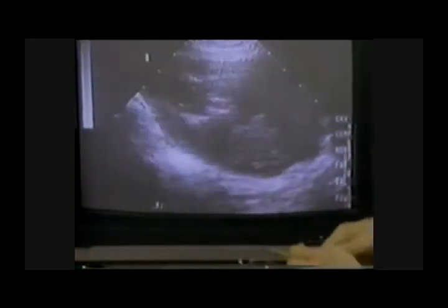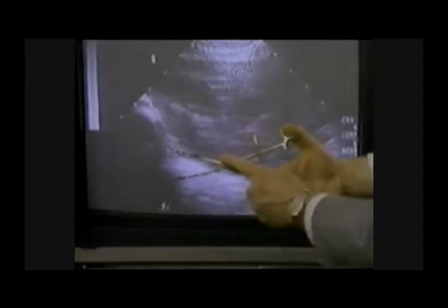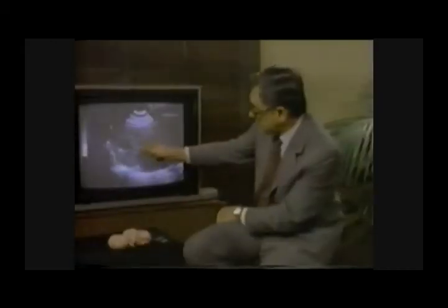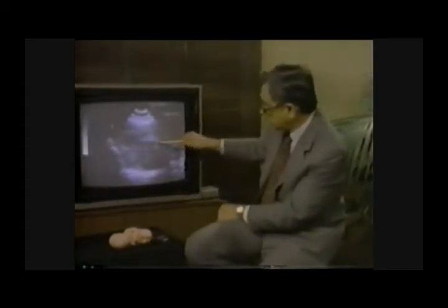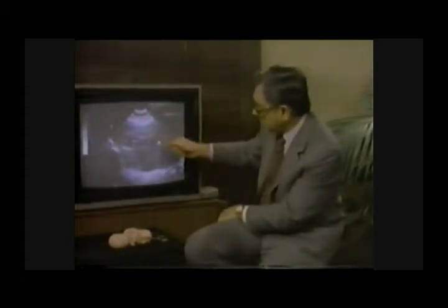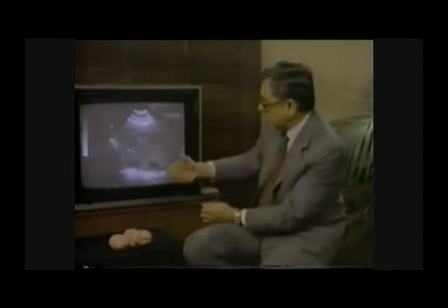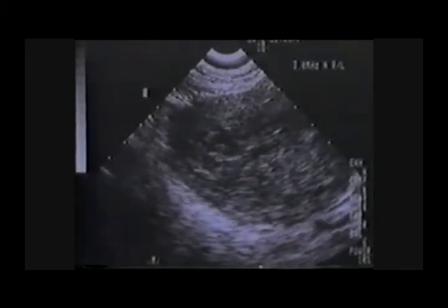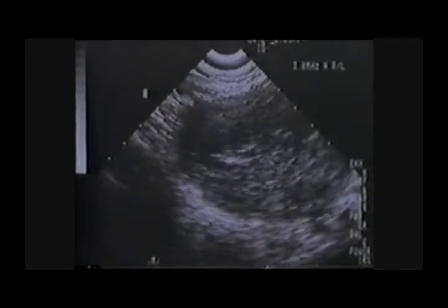We now see intermittently the shanks or blades of this instrument appearing in the image here. The head tends to float freely in the uterus. Here are the shanks or blades of the instrument coming across here. And the head is now being locked on by this polyp forceps, and the head is being pulled down toward the cervix. Now all we see remaining are simply the shards, the broken fragments, the pieces of tissue which document that there was once a living, defenseless, tiny human being here.